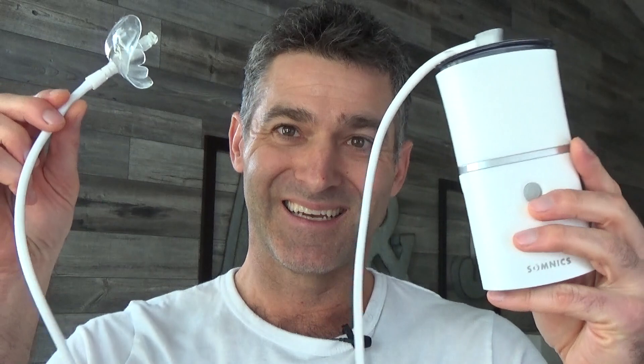This was sent to me by Somnix. If you are not familiar with the device, this is the device. You put this thing in your mouth and you turn this on. What this does is it sucks the air out of your oral cavity, and in doing so it's going to pull forward all the tongue and the soft tissue, the palate, the uvula — pulls it up and out of the way of your upper airway. The theory being that this opens up your airway more, alleviating obstructive sleep apnea, snoring, things like that.